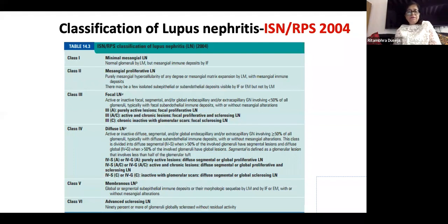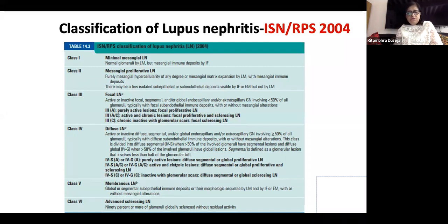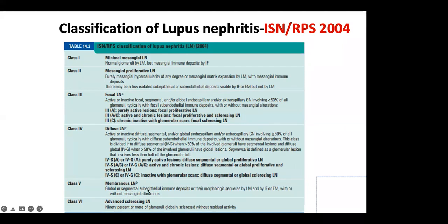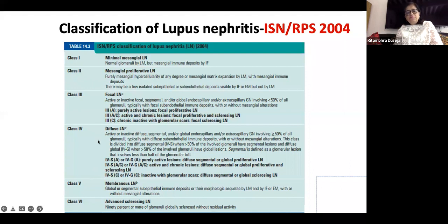Subcategories A and C refer to activity and chronicity, which still exist. In class four, there was something labeled S or G — segmental or global — which has been removed in the updated classification as it was found to be of no use. Class five is membranous lupus nephritis, which could be global or segmental. There could be a possibility that class five coexists with class three or four. In that case, we always give class three or four first, followed by class five.